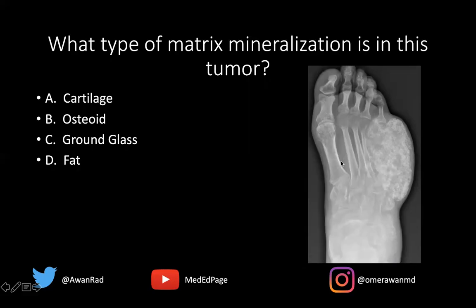This is exactly what a chondroid tumor looks like in the form of rings and arcs. So the answer here is cartilage. This is actually a chondrosarcoma — a nice example of what a malignant cartilage tumor can look like. Five years ago it was very subtle, but it showed very expansive growth over the course of years.